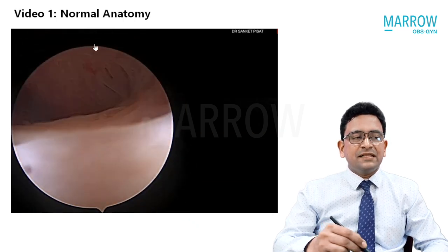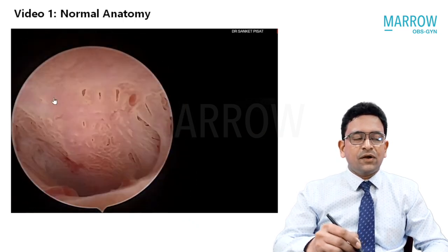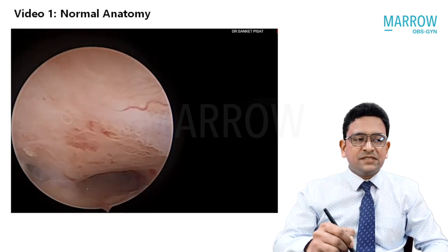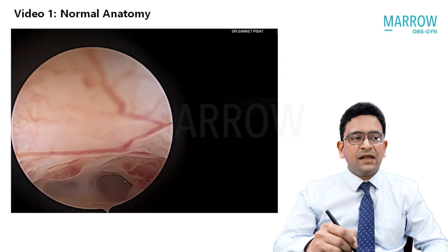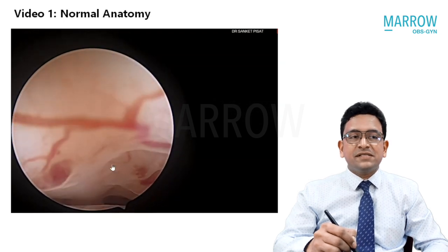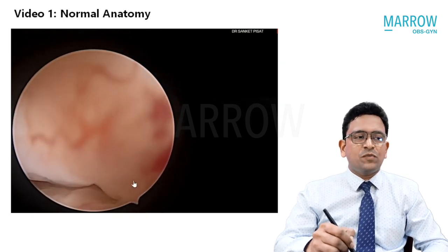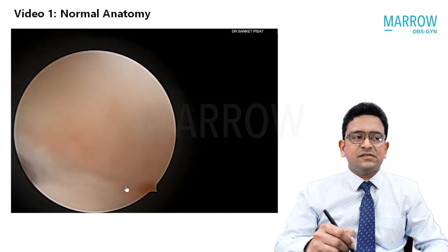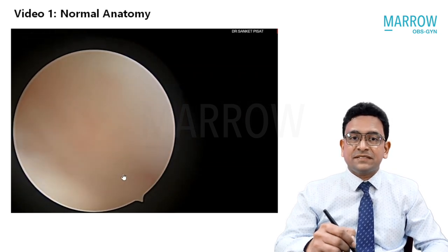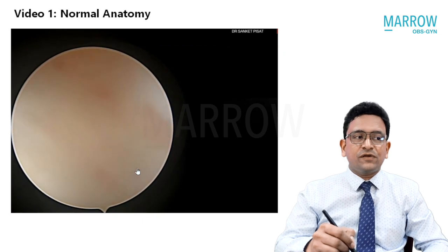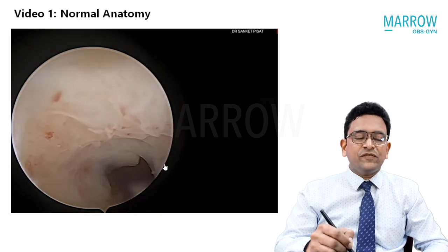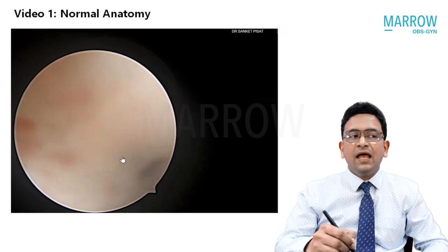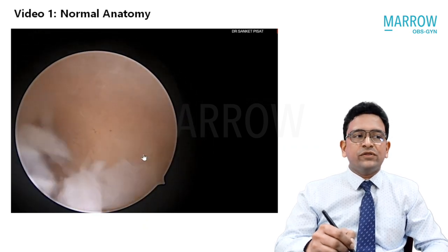You are now able to see the cervix — this is the external os. The telescope is moving inside the cavity; you can see the folds of the cervical canal. What is coming up now is the internal os. The telescope is gradually guided into the internal os, which usually faces some resistance because of its nature.